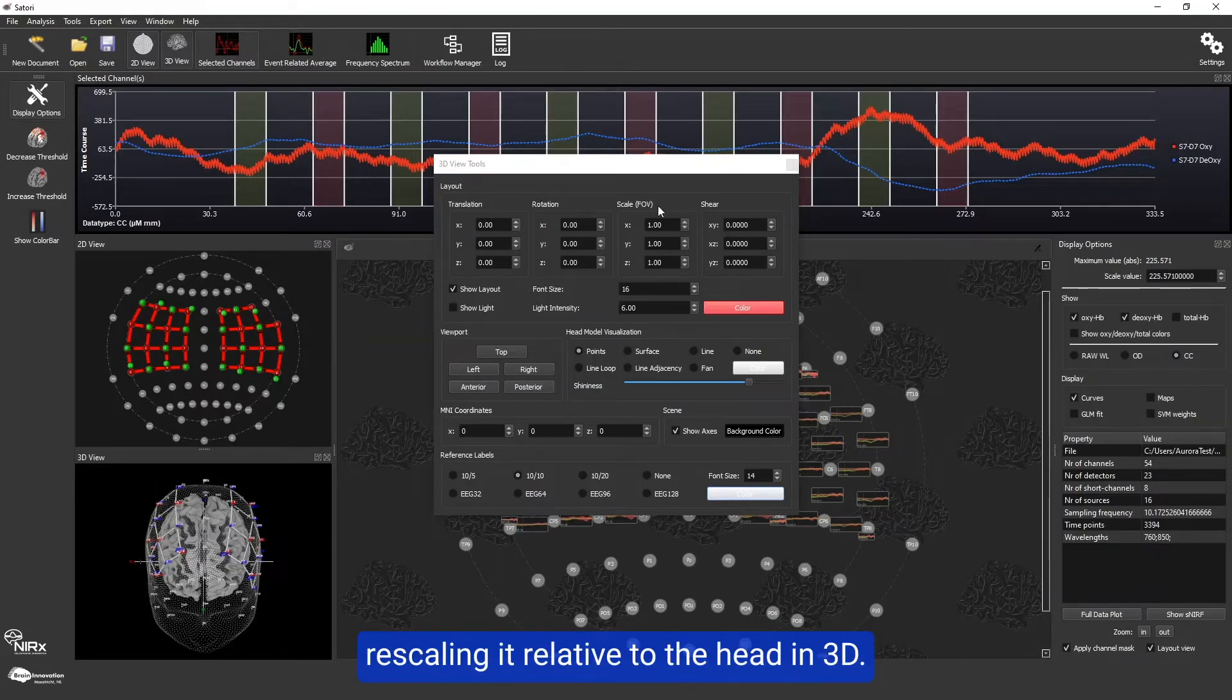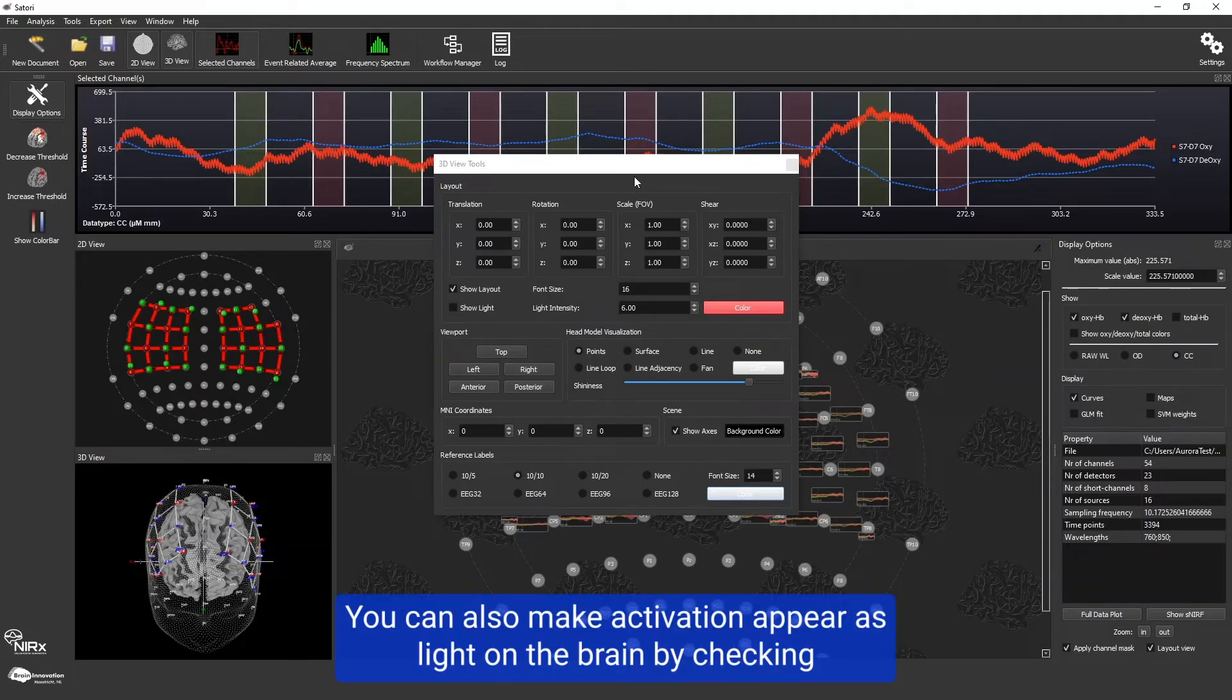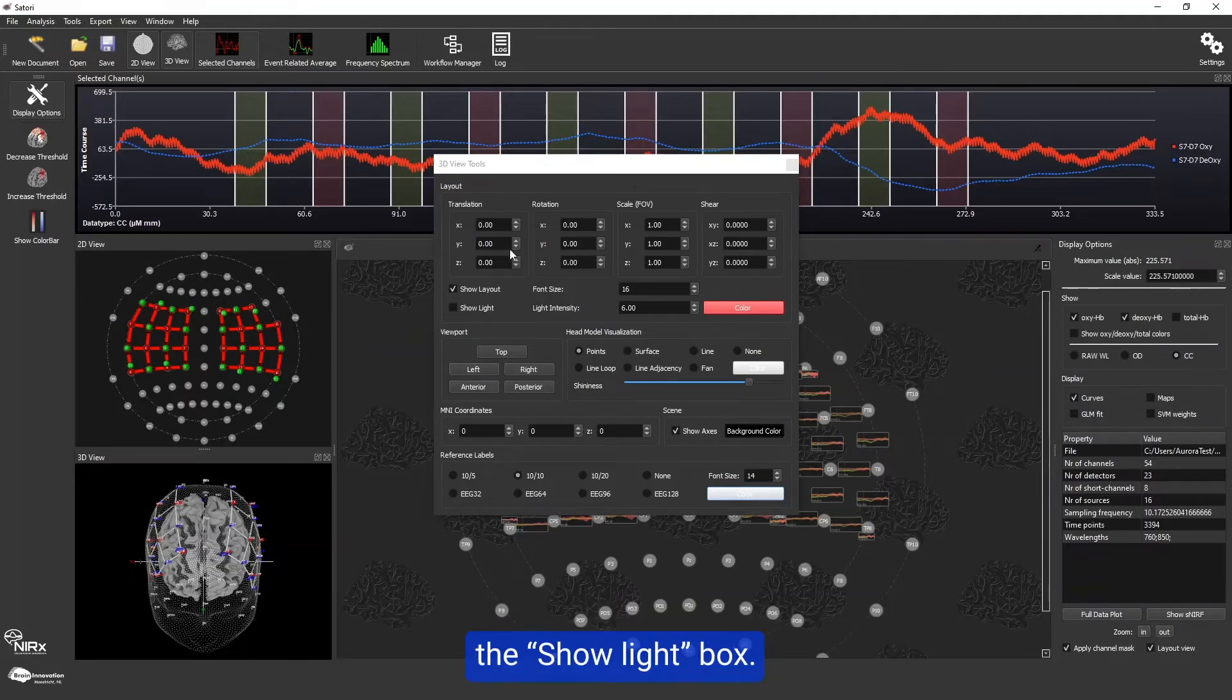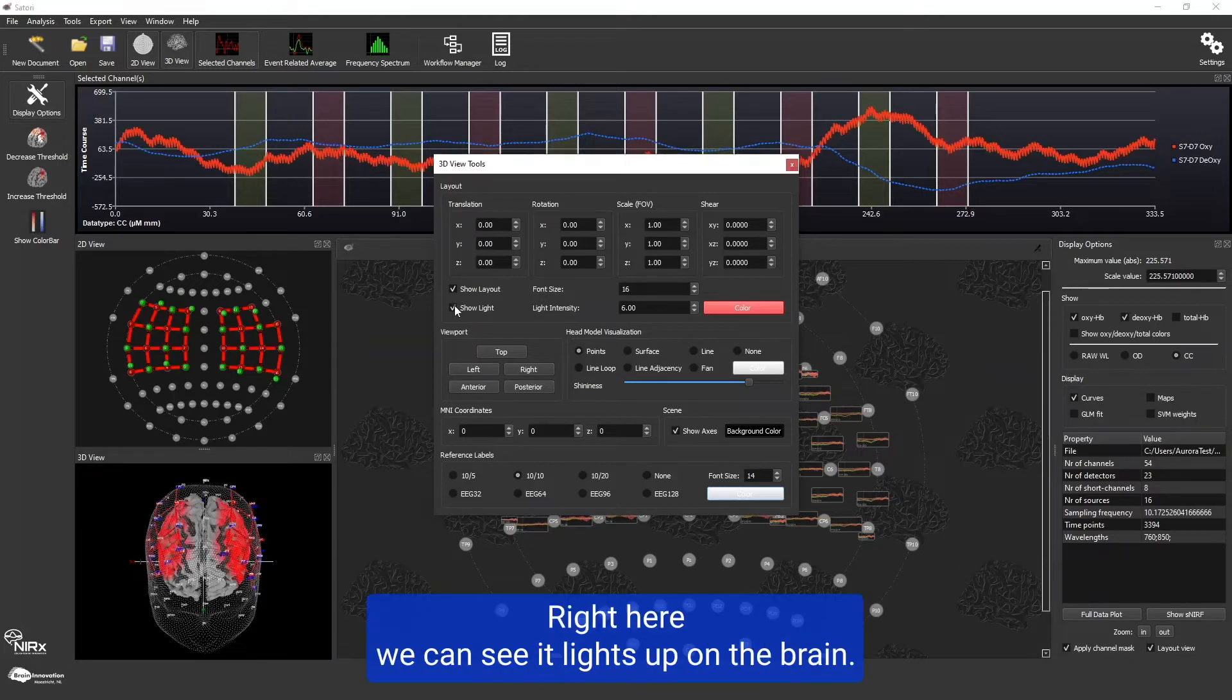You can also make activation appear as light on the brain by checking the show light box. Right here, we can see it lights up on the brain.